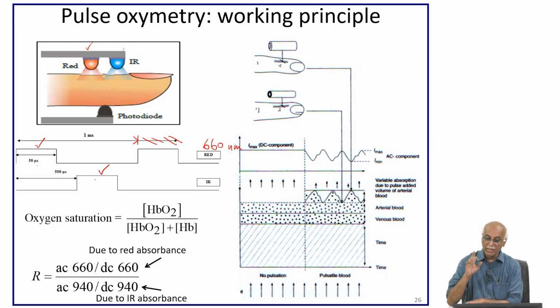So accordingly, the blood supply works at that pulsating rate, and within that pulsating blood supply the measurements are captured. Of course, this pulsating blood supply is trying to capture the signal variation in oxyhemoglobin blood with respect to these measurements.